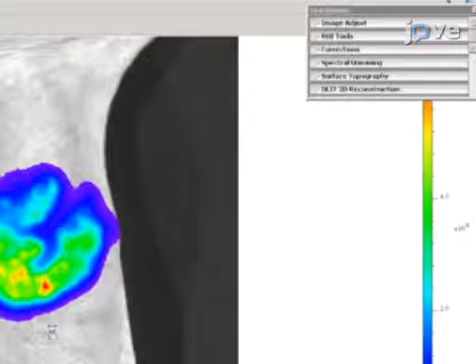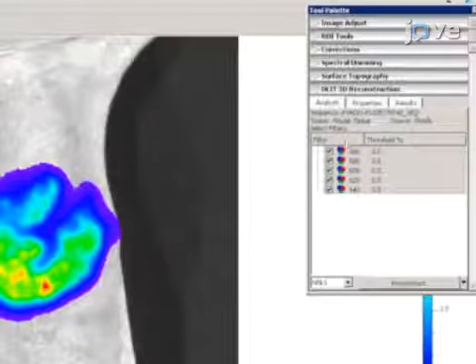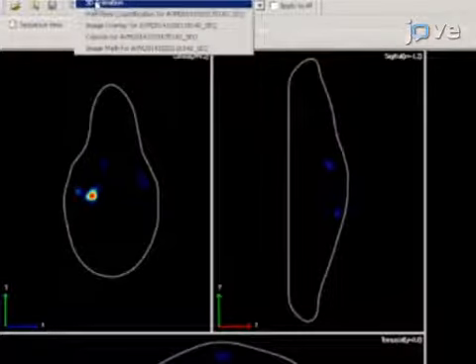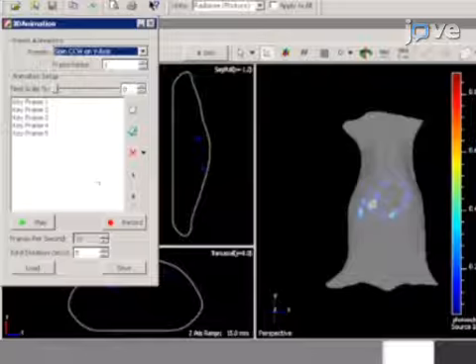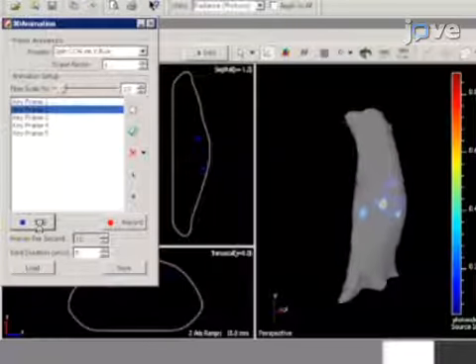After acquiring an image, select the DLIT 3D Reconstruction tab in the Analyze tab and click Reconstruct to generate the 3D reconstruction image. Click Tools and 3D Animation. Then, in the 3D animation window, select Spin CCW on Y-axis. Click Record and Save to save the file into a .mov format file.